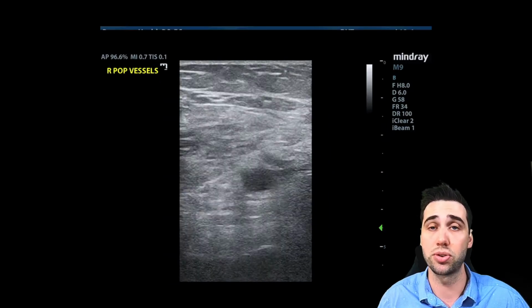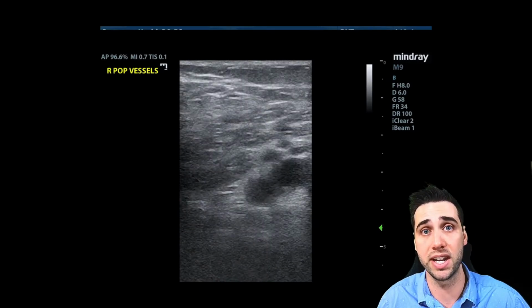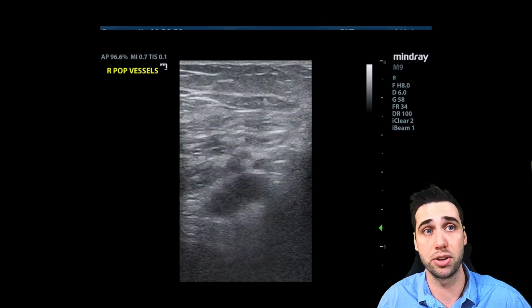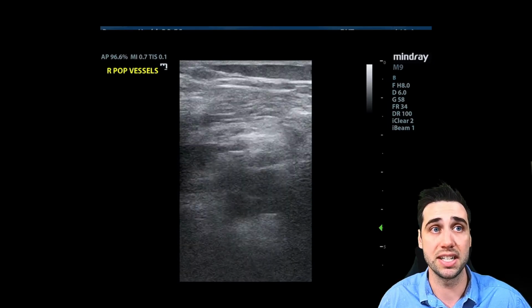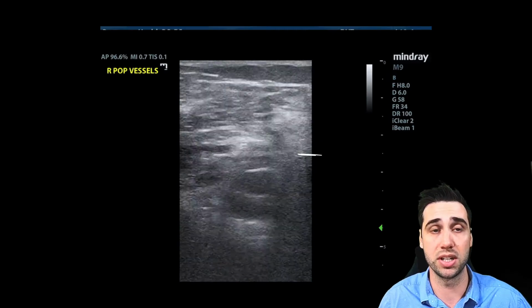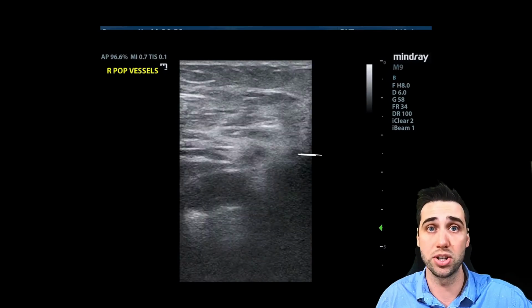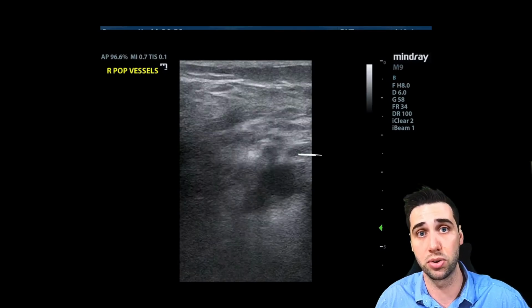And then you have to show the trifurcation of veins. Basically, the trifurcation of veins is the end of the popliteal vein, and that shows whoever's watching your clip that you made it all the way through. Here we can see that the vein on top of the artery up here actually splits into 3 midway through the clip. That would just prove to whoever's watching that you imaged the popliteal vein all the way through and you saw no clots.